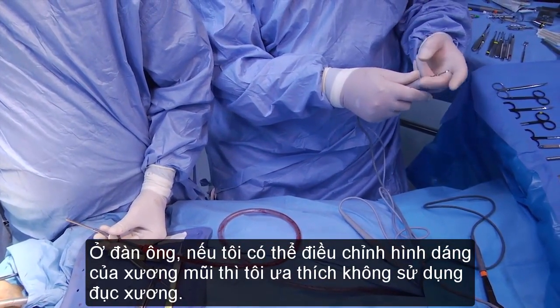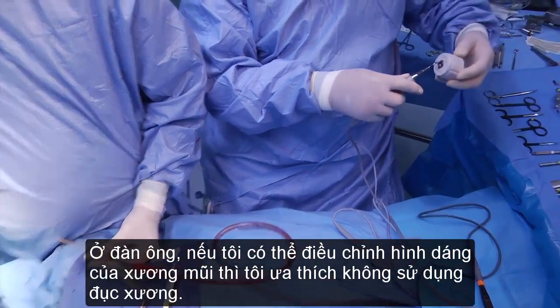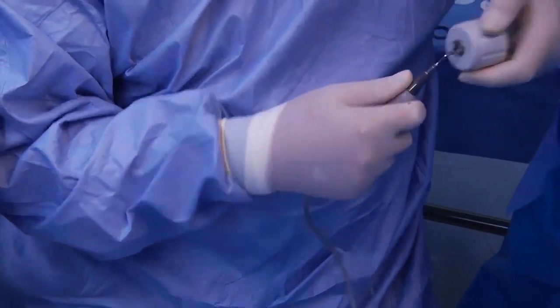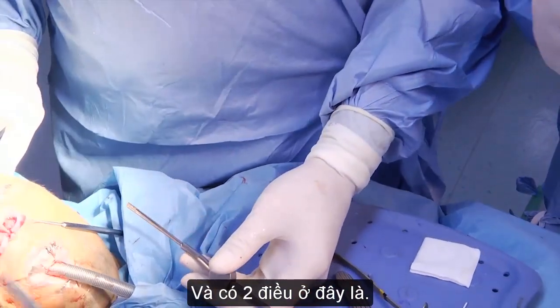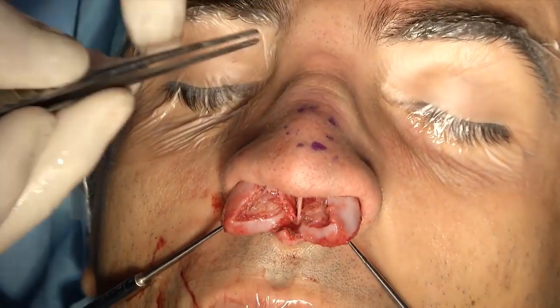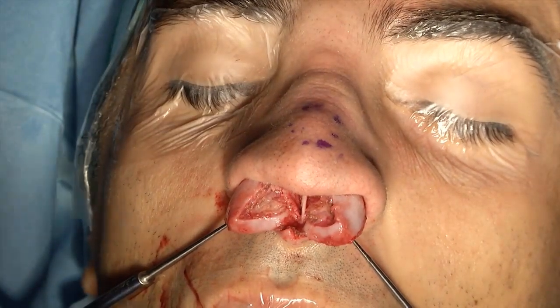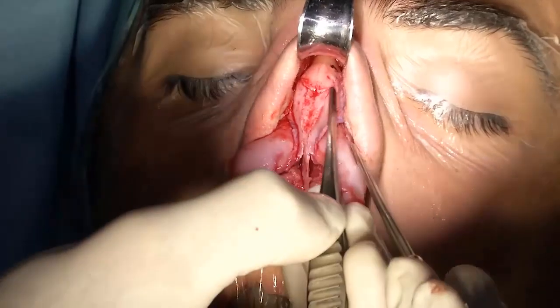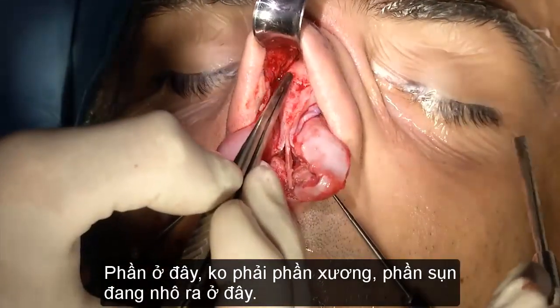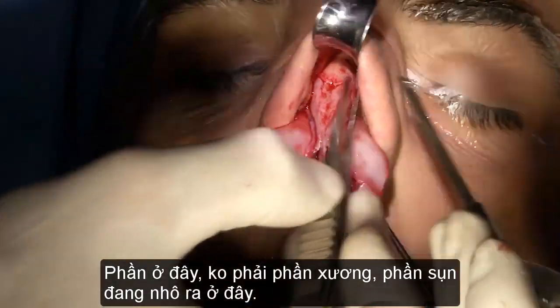You know, in males, if I can manage the shape of the nasal bones without osteotomy, I prefer. And the two things we have here are due to these things here, and especially not to the bone, but to the cartilage protruding here.